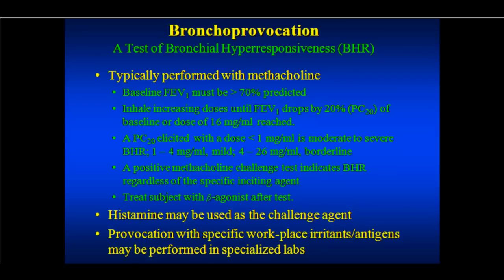Okay? Some fancy, sophisticated labs can actually take workplace materials. They ask the patient to bring them in. They put them in a closet and let them work with the material and measure the FEV1 before and at times after they've been working with the material.